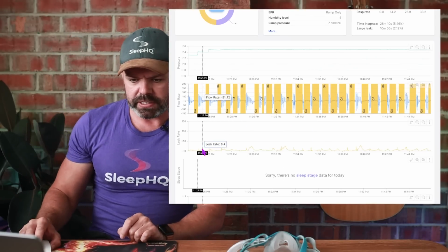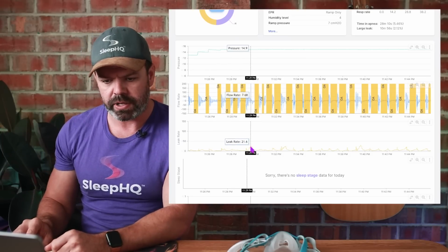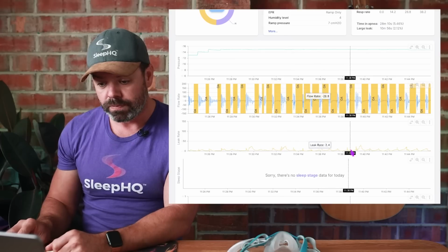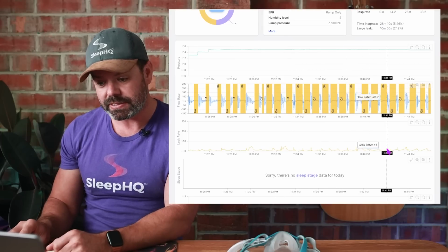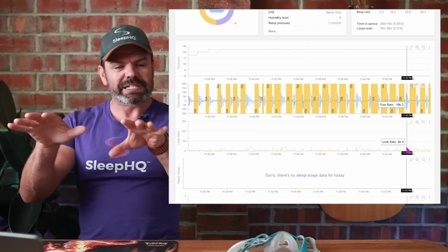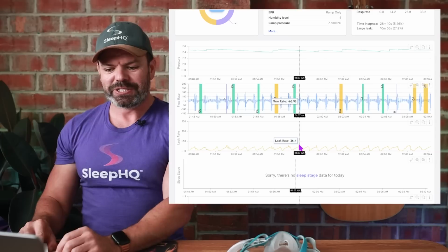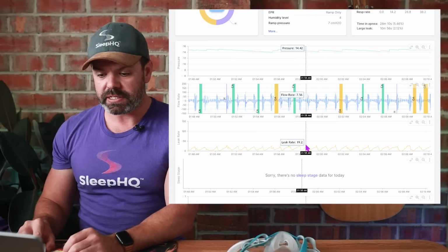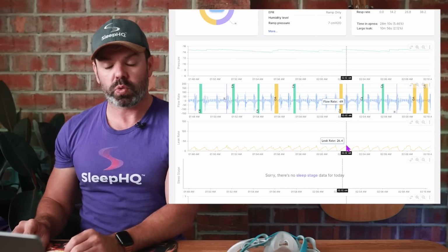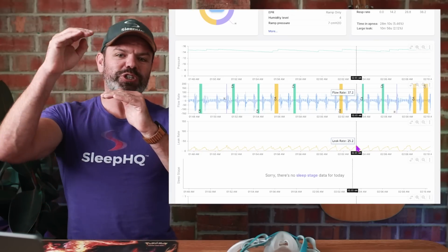So here's the leak rates here down below, and I'll just hover the cursor over them so you can see where they are. So here we go, 22.8, this one's 24, this one's up here, 26, 18, 20. They're around the 20 mark. Now let's go forward. So you can see the leak rates now, 26, 22, 27, 31, 26, 25. It's only a small change.